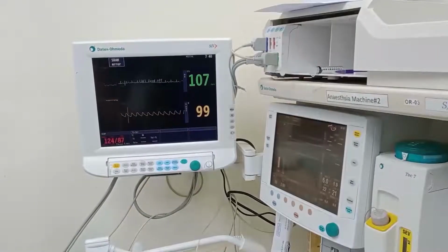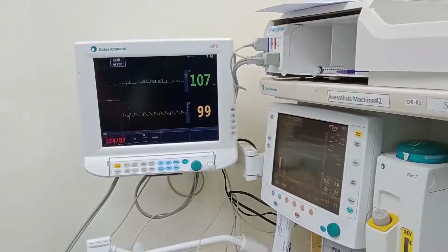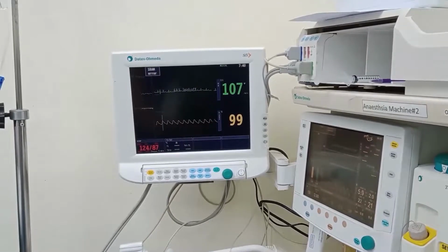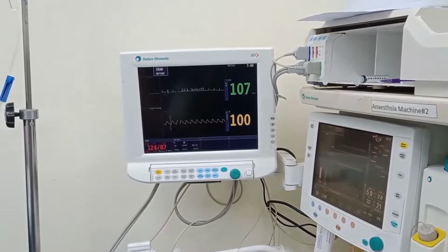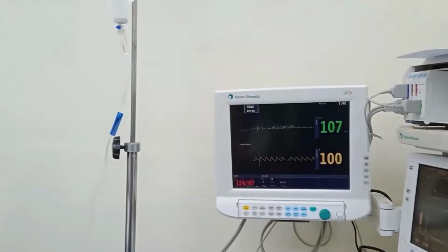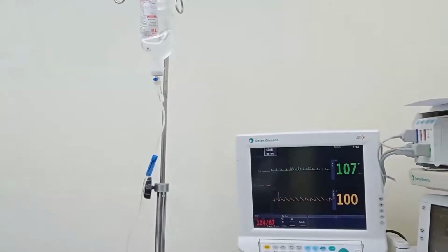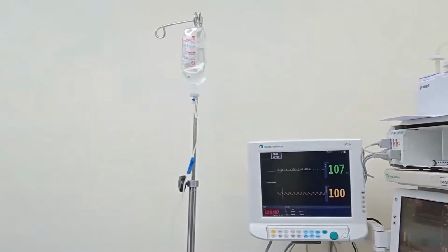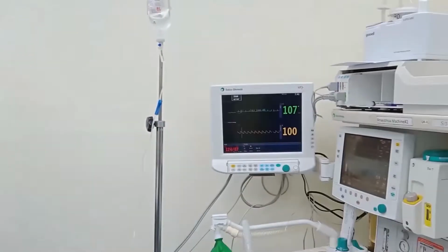Today we are going to do a celiac plexus block, retrocrural approach with 2 needles. For this we would have patient monitoring with ECG, pulse oximeter and blood pressure, and a running IV drip, which is required to counteract the post-procedure complication of hypotension.